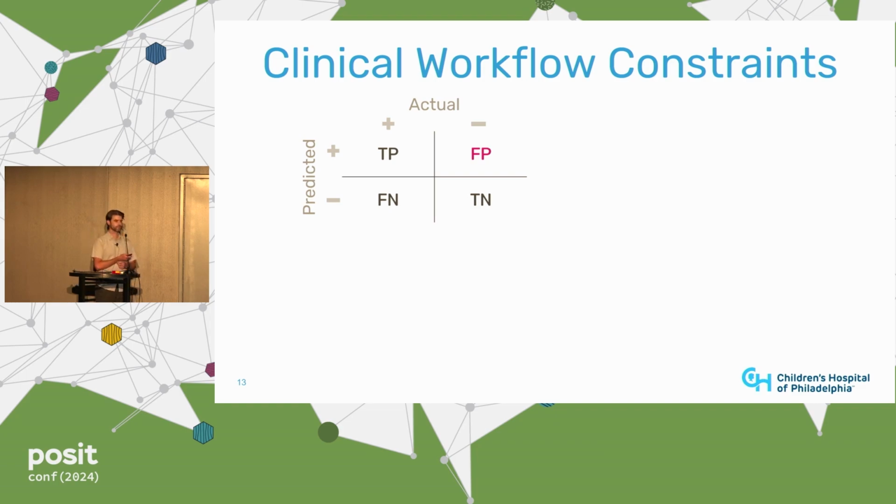And the false positives are highlighted for an important reason, because you can think about a hypothetical scenario in the future where we have this model in production and we make a prediction. We see a sample and we think, oh, this is a WBIT. So now we're living in that top row. We're either correct, it's a true positive, or we've made a prediction and it's a false positive. It's not a real WBIT.